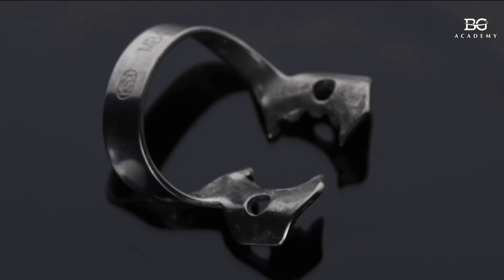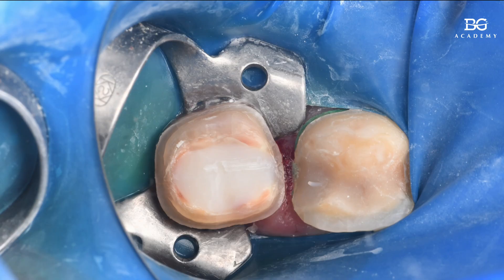Another thing I really want to highlight: it's very important to have the clamp with the bar in a distal position. You have to find these clamps — this one is the 14T by KSK or DANTEC, one of the best clamps with distal orientation of the bar. You place the clamp, and you have room for the preparation even on the distal side, as shown in our video. In this picture, you can see how much room we have in the distal area due to proper clamp selection.